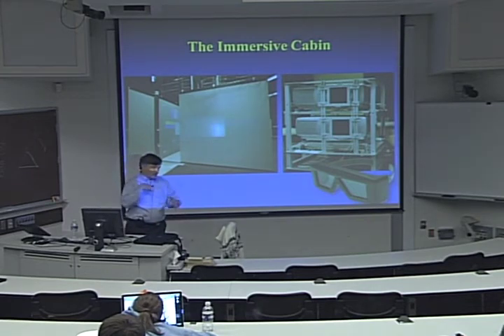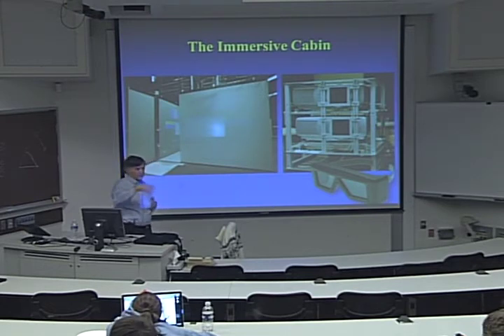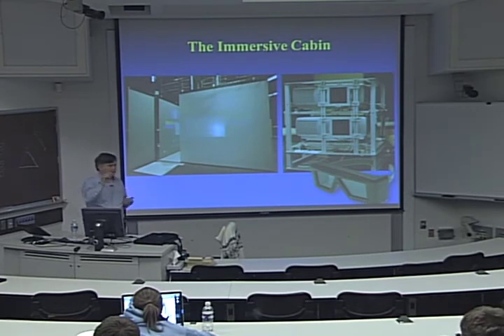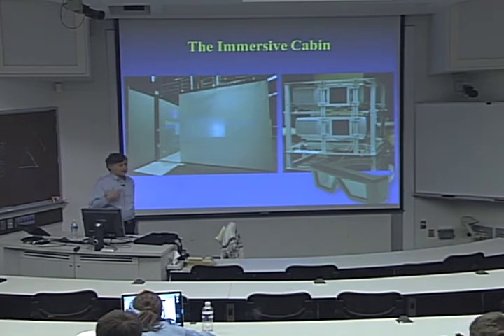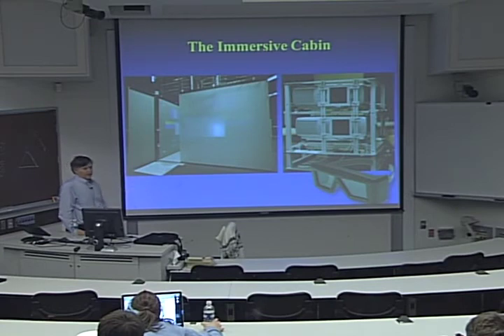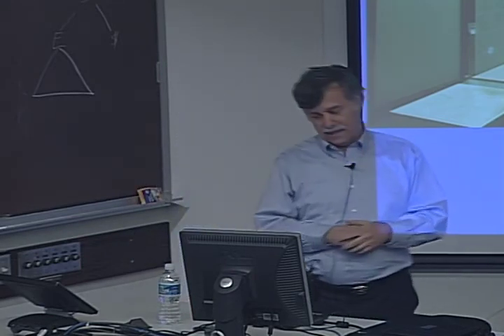you know, depending on the way you construct the virtual colonoscopy. If it's part of the navigation system, so the doctor indeed is looking through the entire colon, that doesn't save much, maybe a minute. But if we do it as a bookmark and you step through them, that can save 7-8 minutes. Typically, an examination takes approximately 10 minutes. So they go in one direction 5 minutes, go back in about 4 minutes, and then another minute spent looking at polyps. So if you can help them in that process, as I said, it's at least a minute, maybe much more. I'm not suggesting that this is more than a preliminary result that we got on only about 90 or so data sets, and we have about 1,000 that we plan to examine, and I'm sure that we will find things that are not 100%.